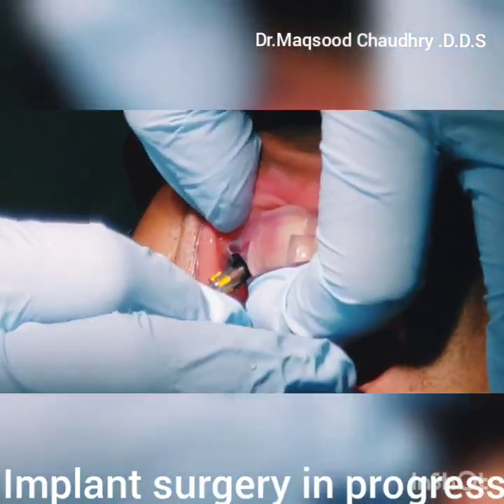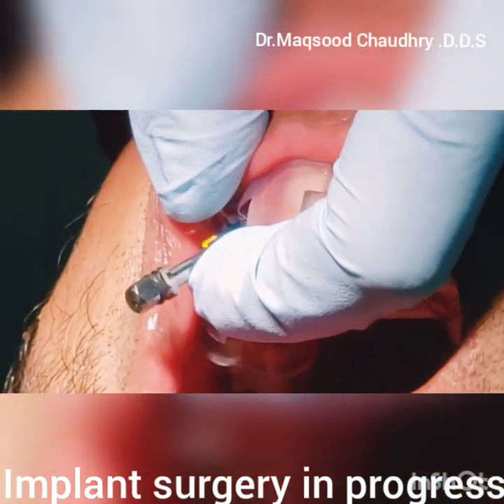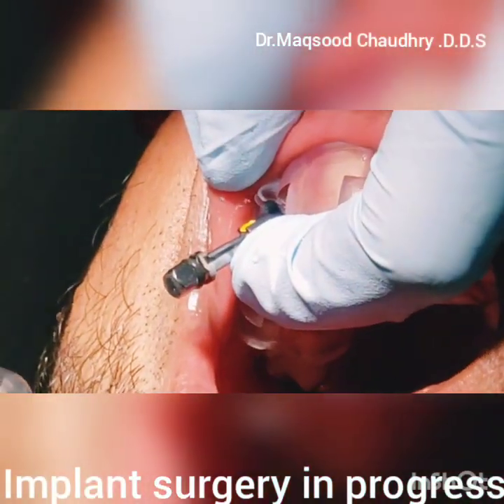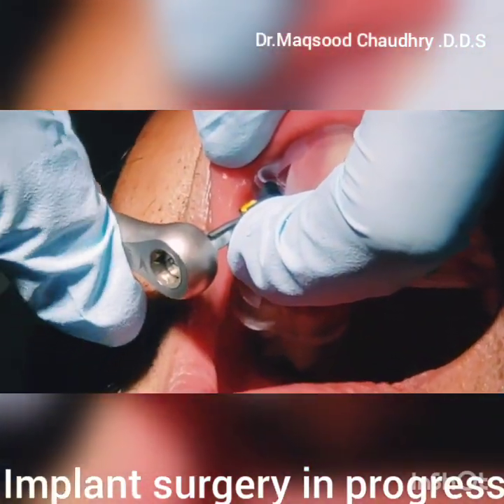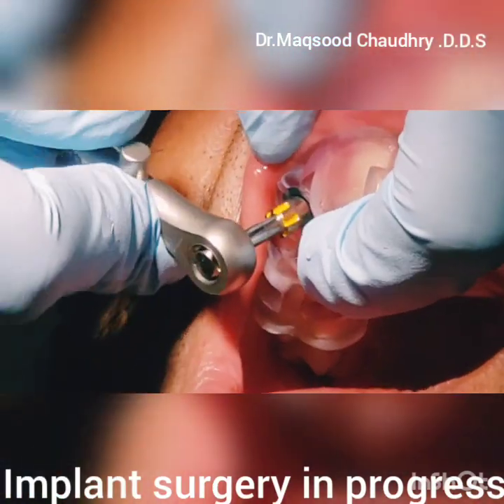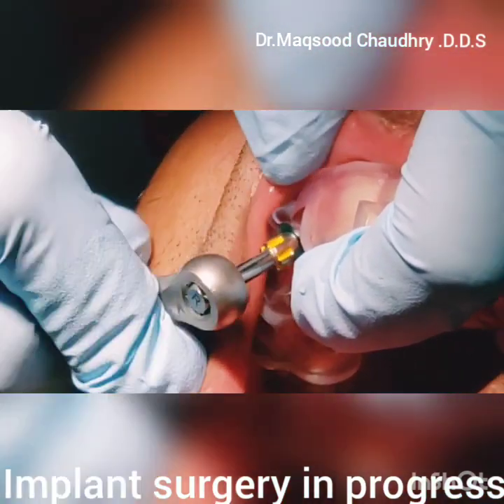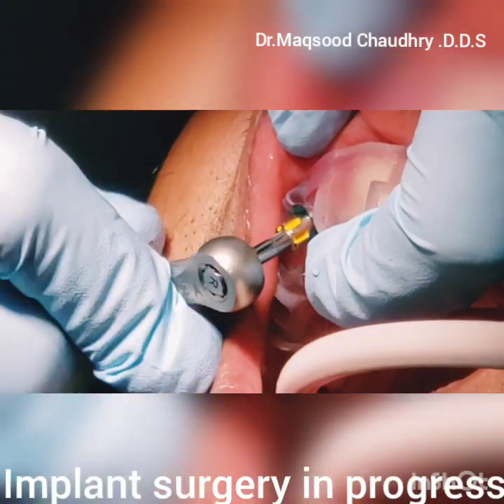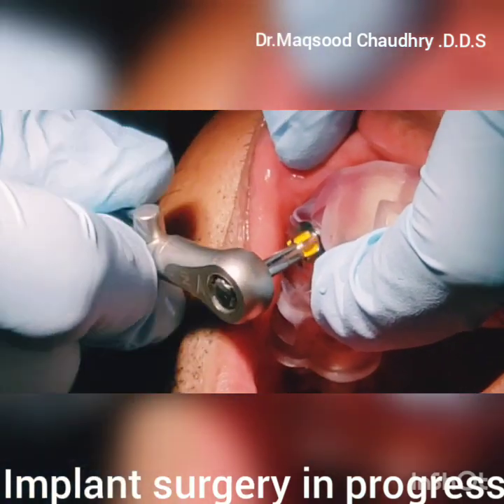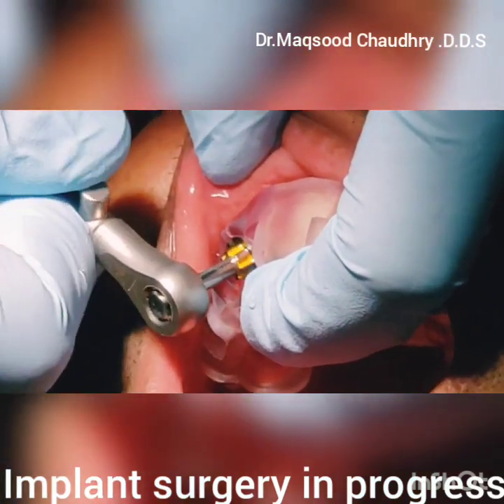Use the driver. Give me this ratchet, please. Bone was a little bit softer. We did the under-drilling. It's a maxillary arch. So to make sure the implant gets good initial stability.